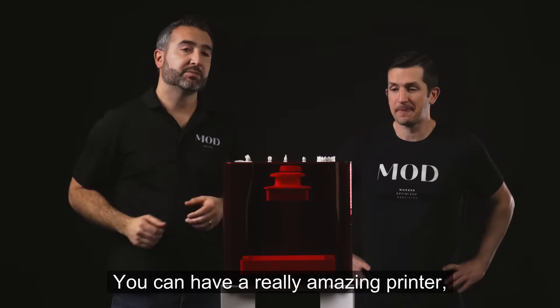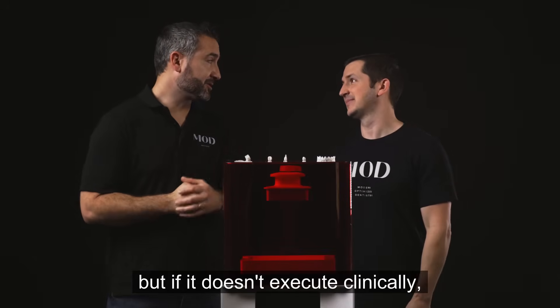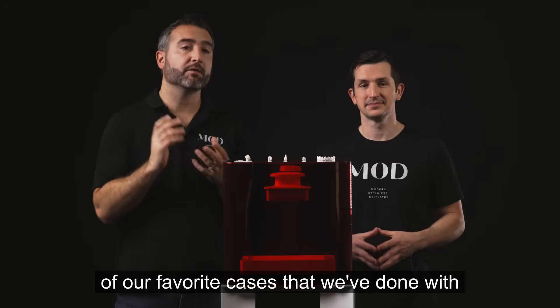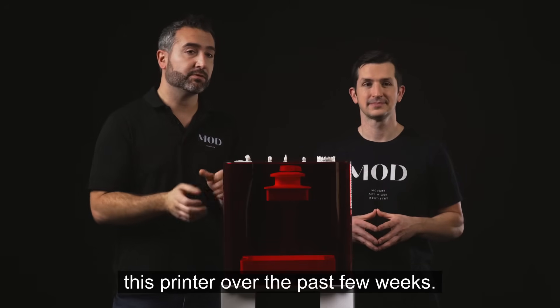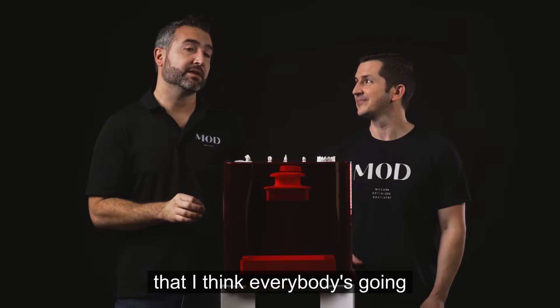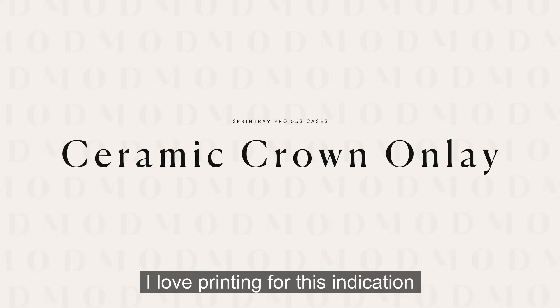You can have a really amazing printer, but if it doesn't execute clinically, it's not going to be of value for your practice. So we're going to take you through some of our favorite cases we've done with this printer over the past few weeks. The first one is something I think everybody's going to be able to relate to — I love printing for partial coverage restorations.